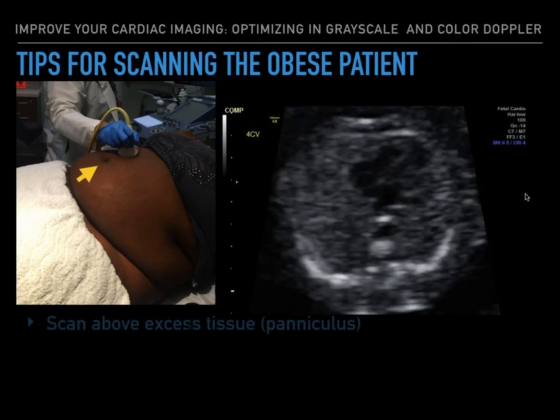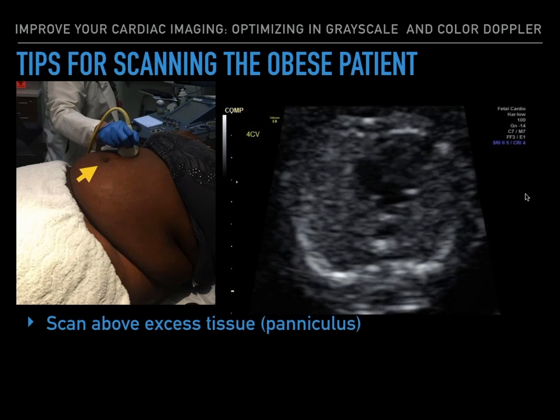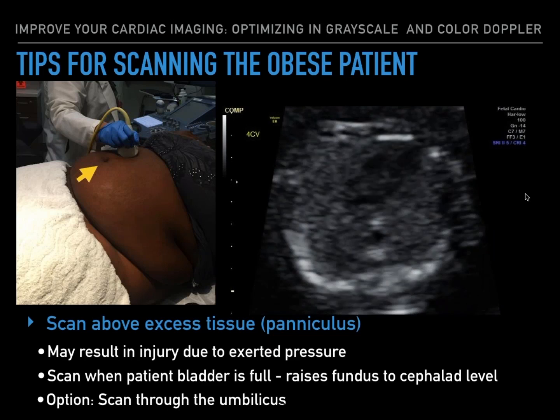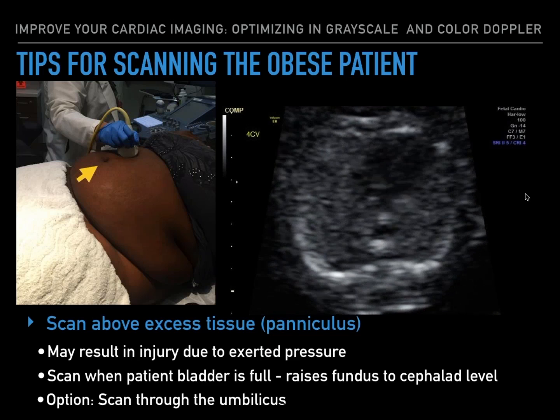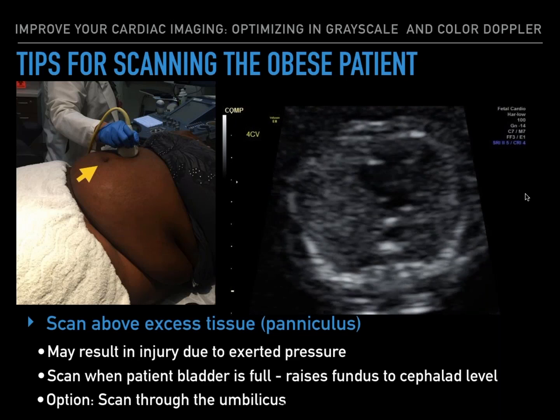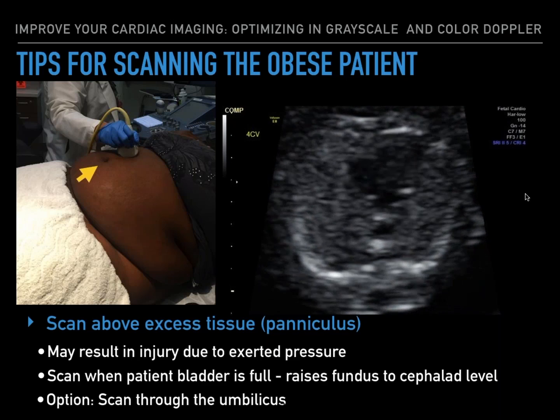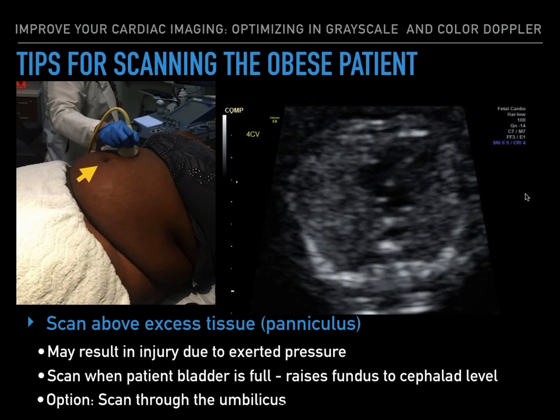Another technique that helps but requires more effort is scanning above the extra tissue. This may result in injury due to the pressure that you're applying on top, because you do have that extra depth to penetrate. Another helpful tip is to scan when the patient's bladder is full, as it raises the fundus towards the cephalad level, and thus you have a decreased imaging depth. Another option is to scan through the umbilicus. That would decrease the distance, but most of the time shadowing may occur.